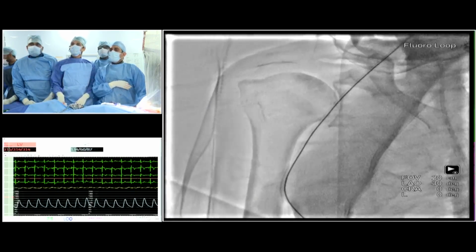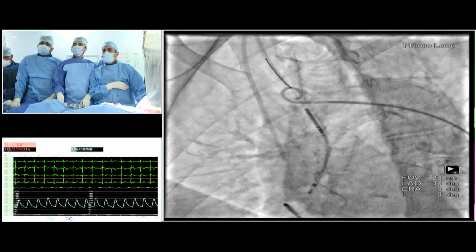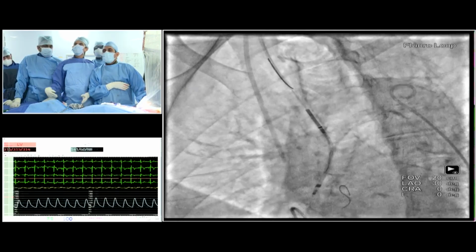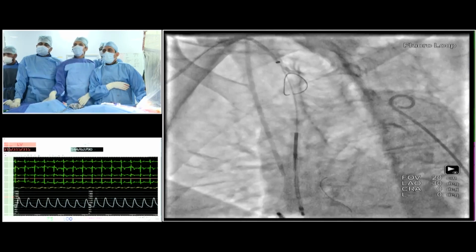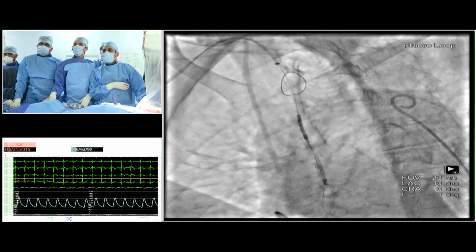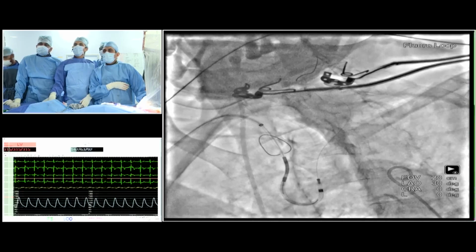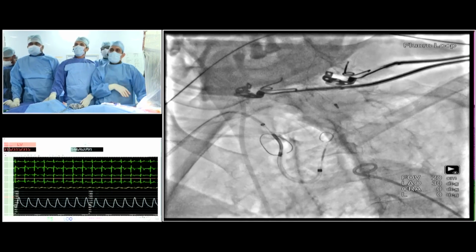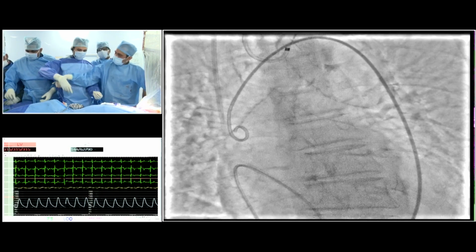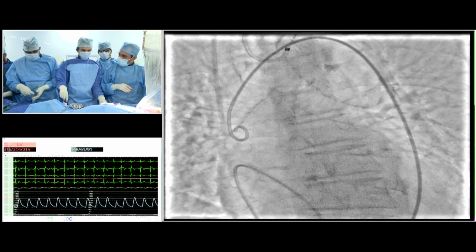And because of heavy calcification, in a nonagenarian, 93-year-old, we decided to do a cerebral protection. Here's a Sentinel device. Next one. The proximal being deployed. Next. And here's the distal one which is deployed. And we just advance the pigtail to make sure it is not coming in the way. So the 9-French sheath is removed. And now we'll go ahead and use a Python sheath, which is an expandable sheath.